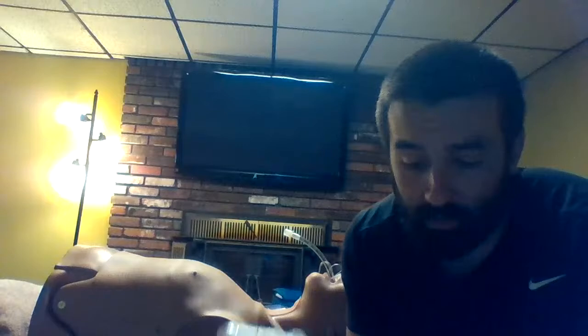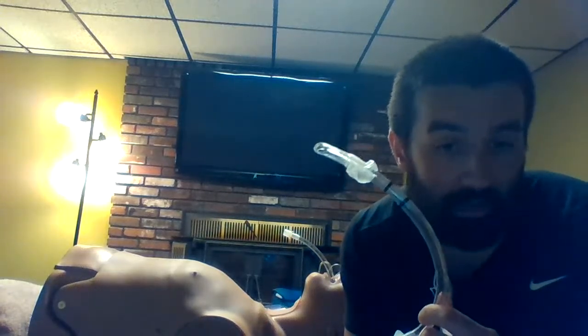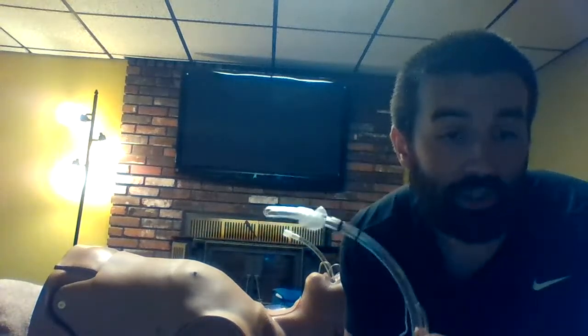Sometimes it's a little tear in the pilot line. Sometimes it's just a tiny little separation up here. So I'm always curious to check it in water, but you don't necessarily have to. So that's using a bougie to exchange an ET tube. They do make some other tube exchangers that are not as rigid and stuff like that. The bougie really is for intubation and everything as well. But it's a very versatile tool, and it's an essential part of every difficult airway cart.